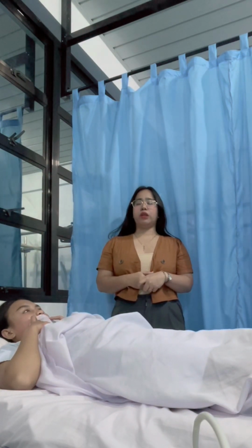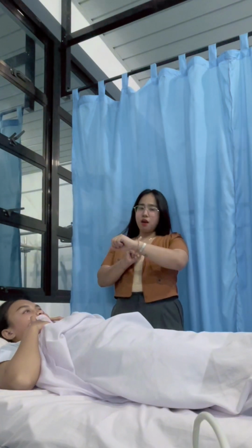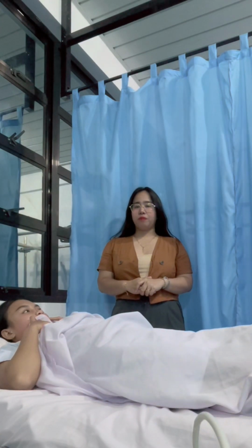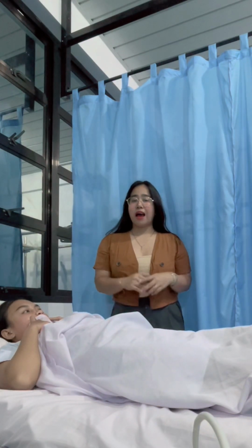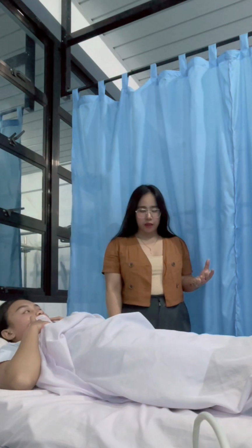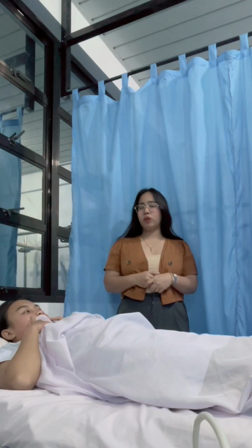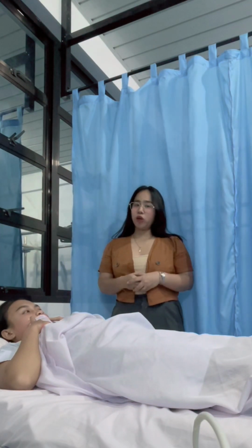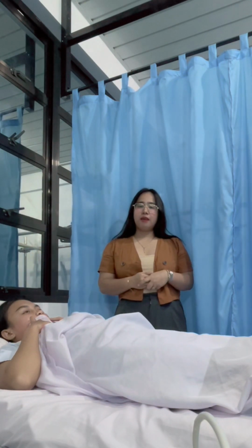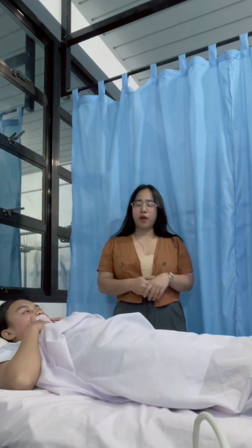So next, we need to assemble all the equipment, such as a wristwatch that has a second hand or indicator, the nail polish remover as needed, the pulse oximeter, the antiseptic wipes, and the sheet or towel. Next, we need to introduce ourselves to the patient, verify the client's identity, and explain to the patient what you are going to do and how the patient can cooperate.